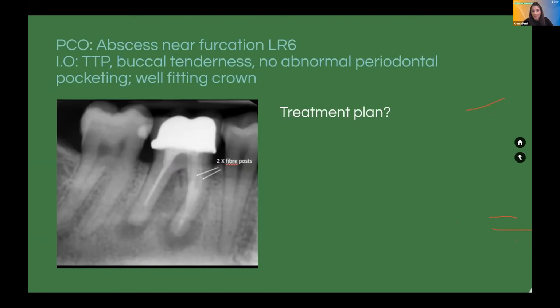with the mesial canals. So in terms of having a look, I didn't want to do a root canal retreatment in this case because removing that probably is going to be unrestorable, because the dentist has felt that they had to put obviously 2 large fiber posts in order to retain that core. And so there's unlikely to be very much tooth left underneath that crown, first of all. And second of all, it's going to be really difficult and really destructive to remove those fiber posts. So if there's any option here, it's either an extraction or potentially root canal apical surgery.